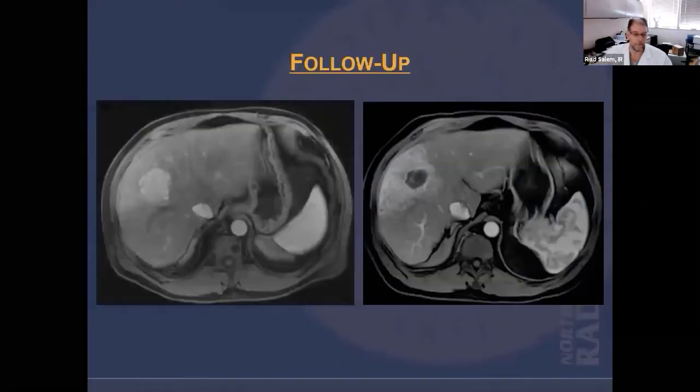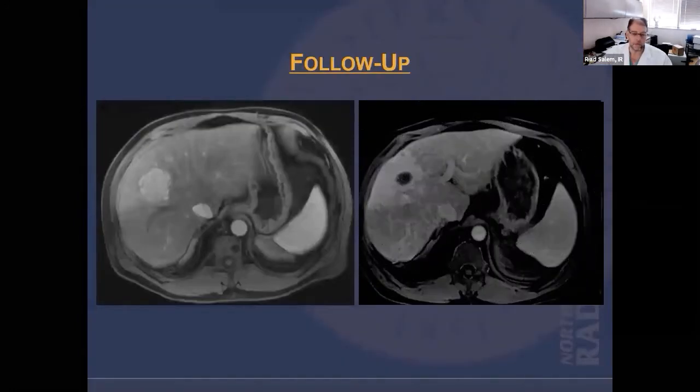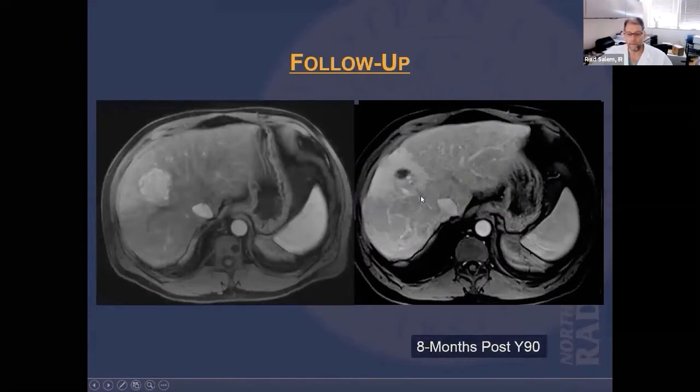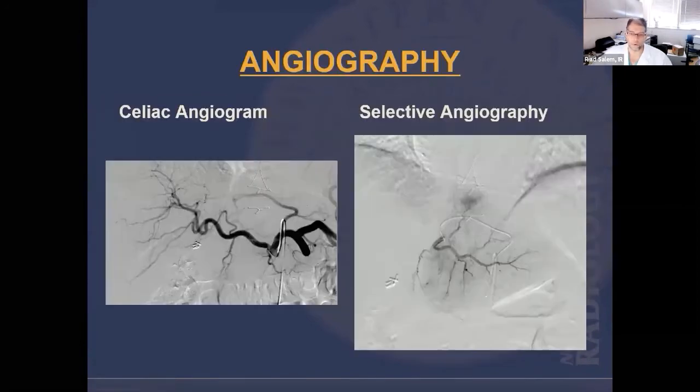And so this is an example of a radiation segmentectomy. You can see this with a good response, and you can see the necrosis and the radiation effect. And you show that exactly the radiation is targeted in the liver and nowhere else. And that's really what you want to do. And you have a good response here after one segmental radioembolization.